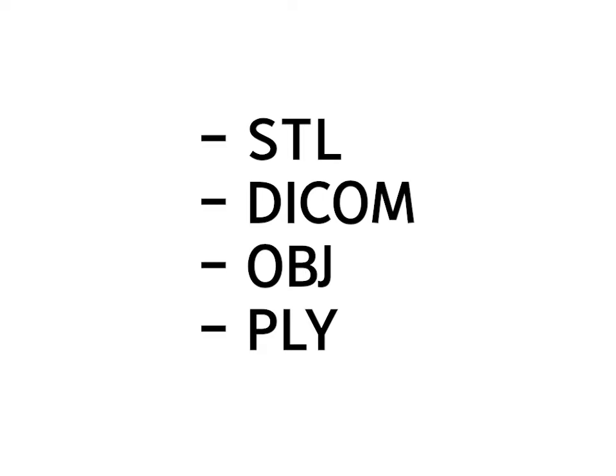Another commonly used 3D image file is the OBJ file, the acronym of object, which was developed by Wavefront Technologies. Unlike STL files, OBJ files contain information on texture and color of the 3D object. They are used by some facial scanners in the field of dentistry.